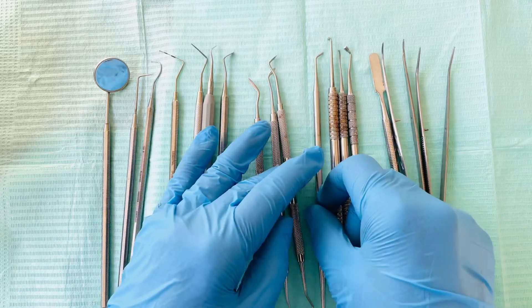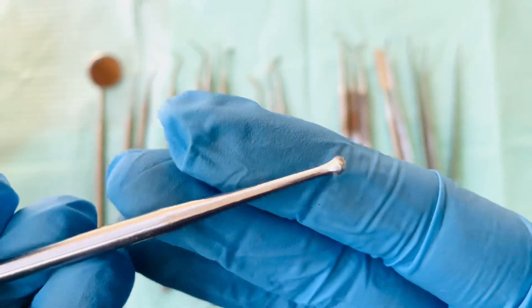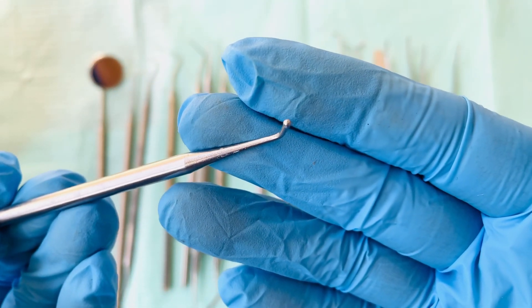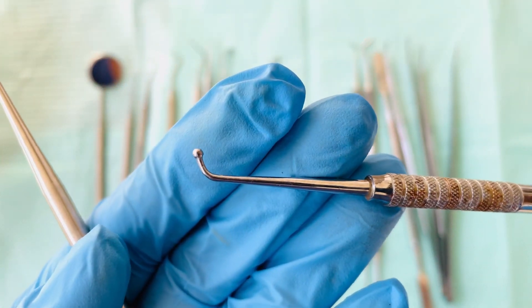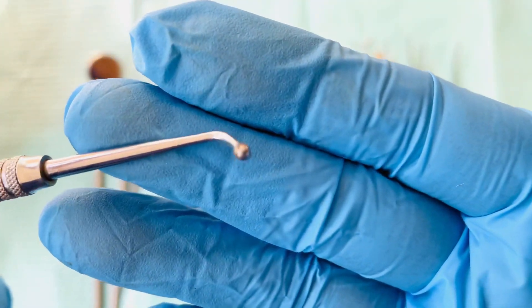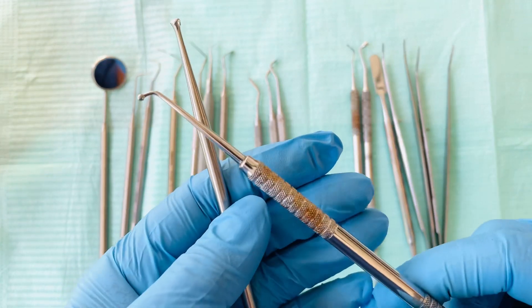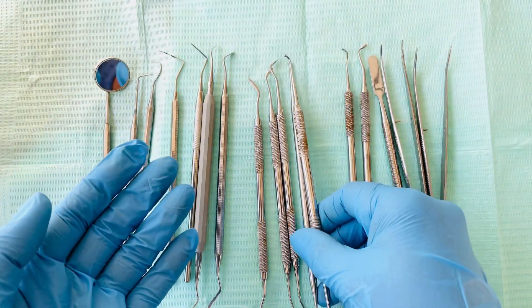Next we have the ball burnisher. The burnisher has different ends — this one has a pear-shaped end, and the other end is a ball end. We also have a different burnisher: a ball burnisher with a smaller end and a bigger end. The ball burnisher is used to adapt composite fillings and also to polish amalgam fillings.